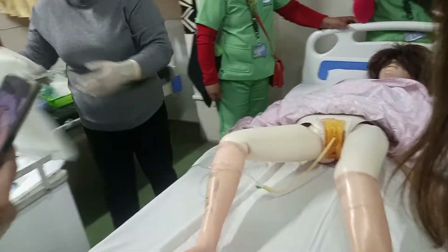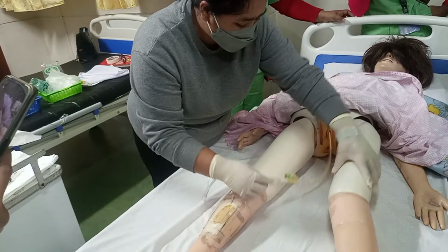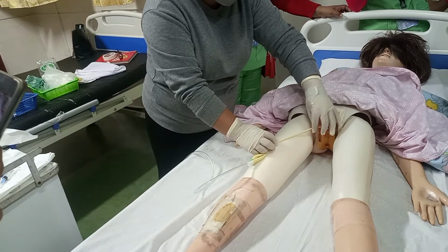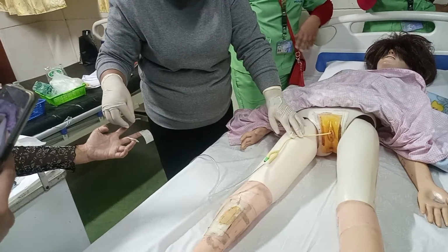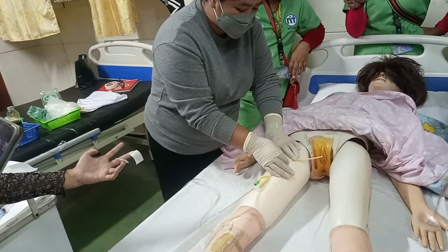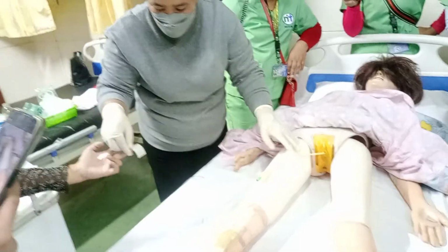Okay? Unsterile na ako nito, ah. Then, there you go. So, asan na yung aking circulating? Pag lalagay kayo ng tape, make sure ninyo na may space for your patient para ma-move ang legs. Catheter na. Now, tape 1 in the catheter.